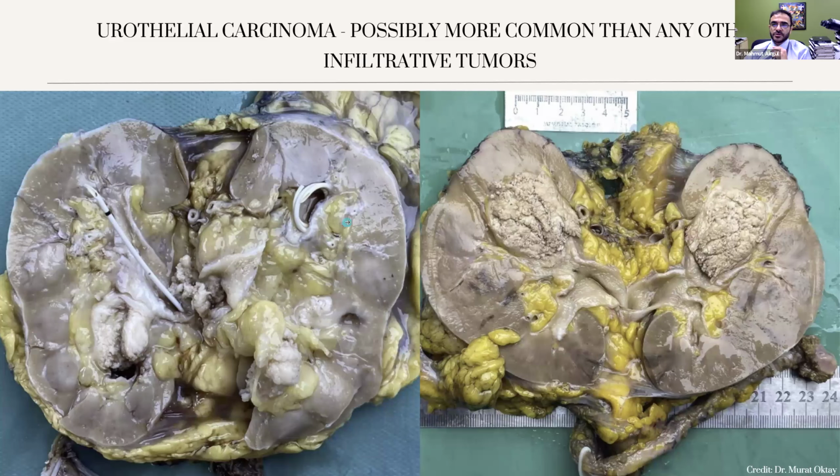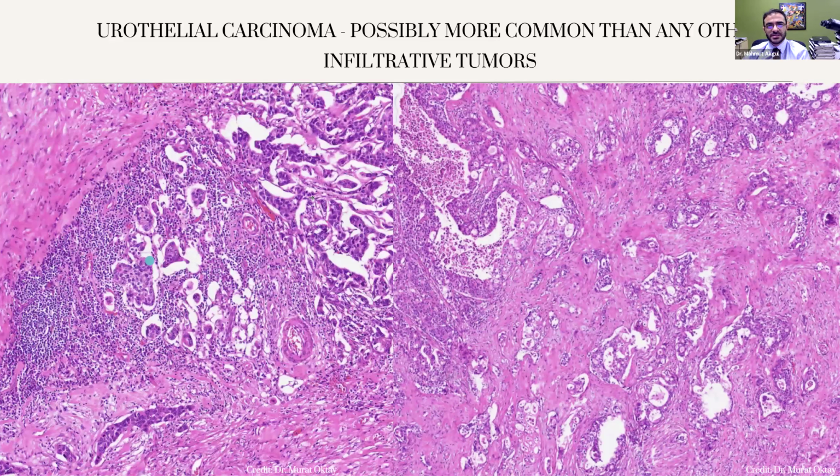There is cribriforming type morphology in these tumors, but these tumors are pleomorphic, having high nuclear grade. They are somewhat tubular. Again, there is some cribriforming, but collecting duct carcinoma can have those tubules as well. In summary, they can look like collecting duct carcinoma or renal medullary carcinoma. And you can see subtypes of urothelial carcinoma. It is not a very amazing example, but this is probably focally micropapillary subtype urothelial carcinoma. These are from the same case, by the way.